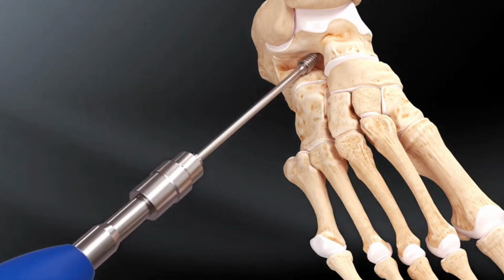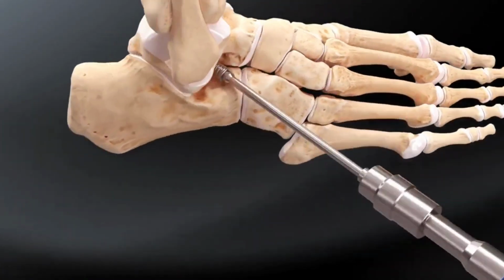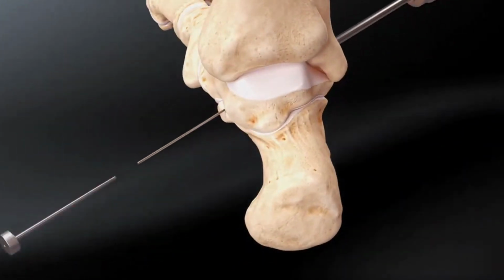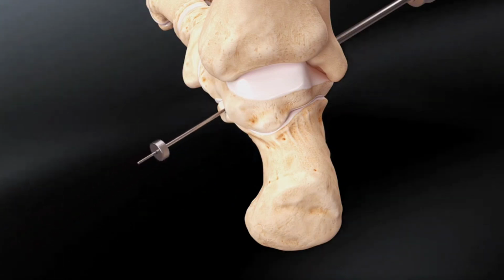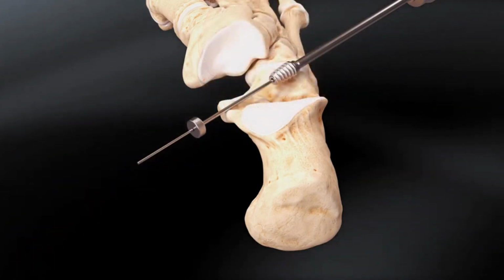If the implant is turning idly without moving towards the skin incision, the ProStop arthroereisis extraction tamp can help to push the implant from medial. Advance the K-wire to medial and incise where it tents the skin. Slide the extraction tamp from medial over the guide wire and push the implant while turning it counterclockwise with the driver.